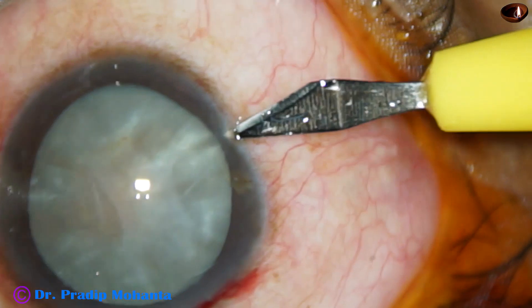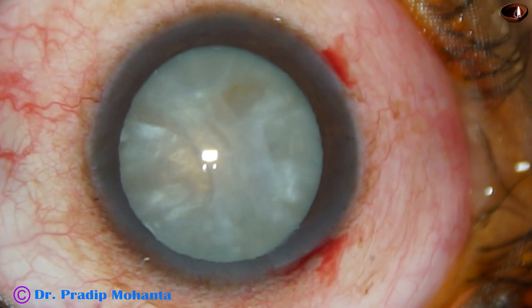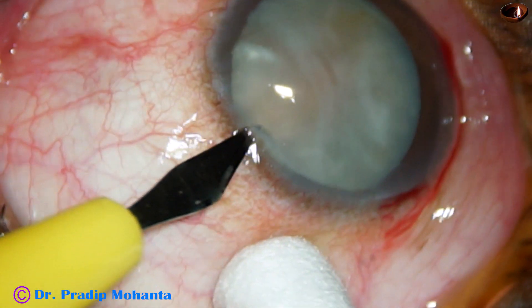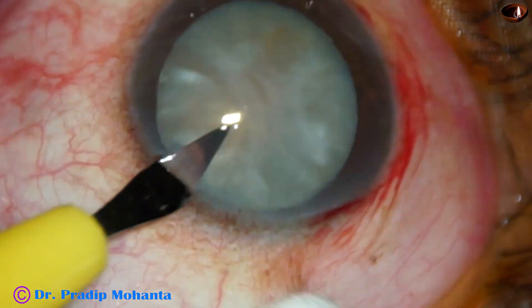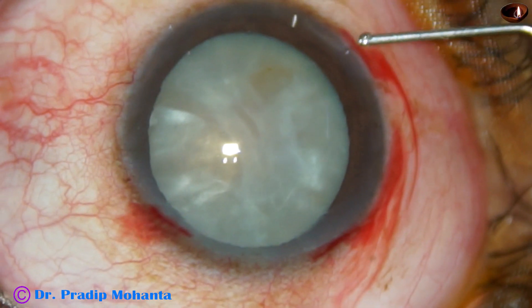The main incision has been made. There is a side port on the right side of the main incision and one more side port is being made on the left side of the main incision. The side ports are about two and a half to three clock hours away from the main incision.